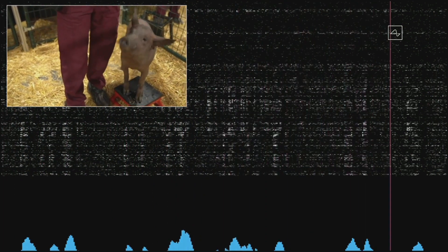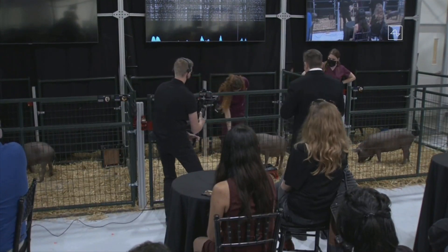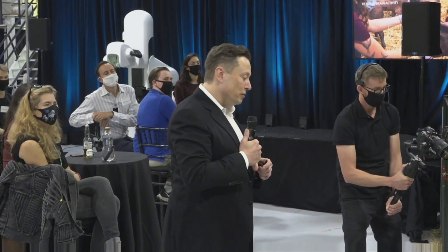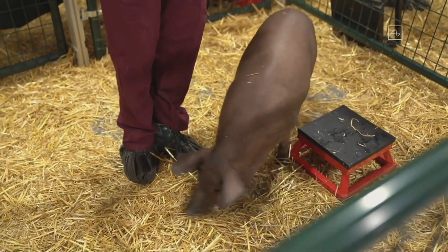That's what's making the beeping sound. As you can see, we have a healthy and happy pig — initially shy, but obviously high-energy and kind of loving life. She's had the implant for two months, so this is a healthy and happy pig with an implant that is two months old and working well.